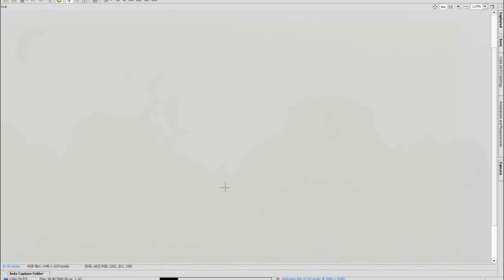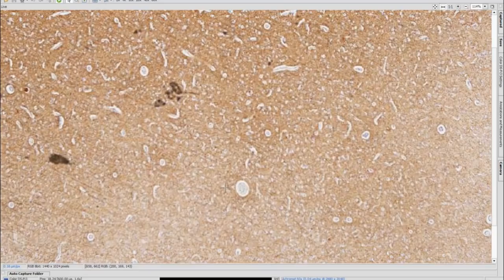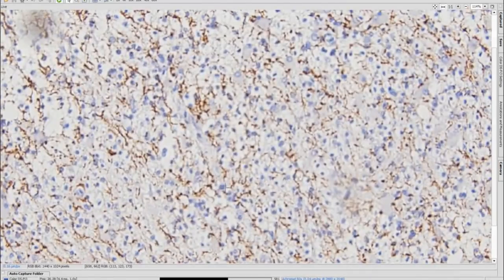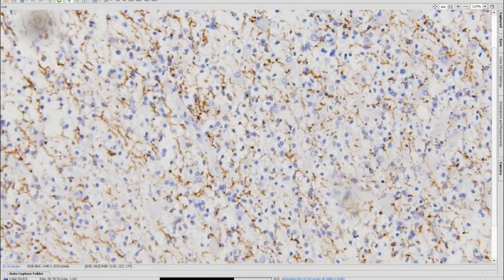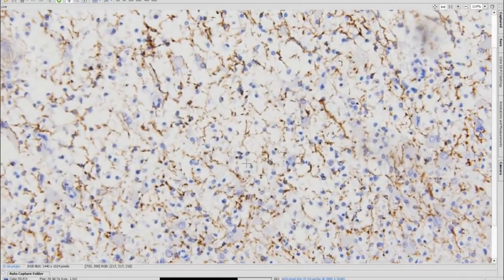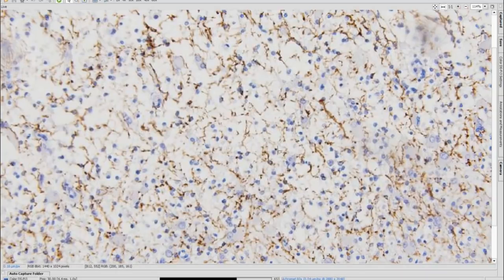In the context of a macrophage-rich lesion, one of the most useful stains is the neurofilament protein stain — I recommend using it frequently in these cases. Going to high power in the area of abnormality, which is very cellular, you can see a slight decrease in axonal density, but they are relatively preserved. These linear arrays of axons tell you the axons are there. What is being lost is the myelin, so you can complement this with Luxol fast blue or another myelin stain. The key comment is that there is relative axonal preservation.